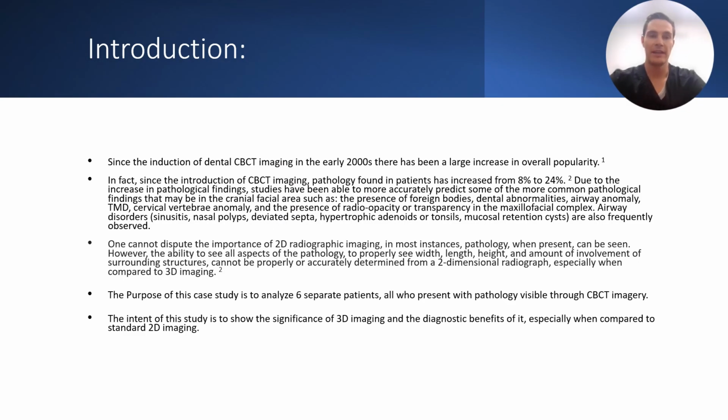Diving into the history of CBCT imagery: it has gained a lot of popularity since its introduction in the early 2000s, and for good reason. Some studies have shown that while using CBCT imagery, the pathology found has increased from about 8% to 24%. This includes the ability to find more foreign bodies, dental abnormalities, airway anomalies, TMD issues, cervical vertebrae anomalies, and so on.